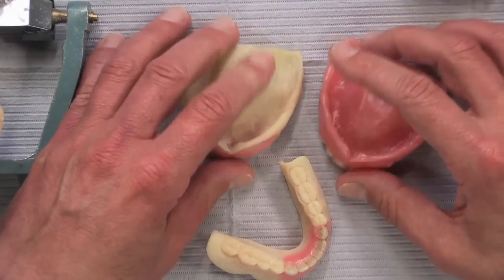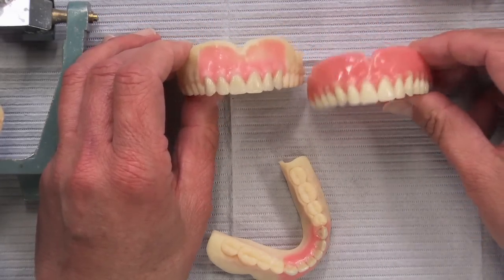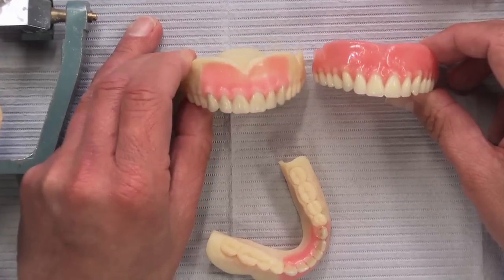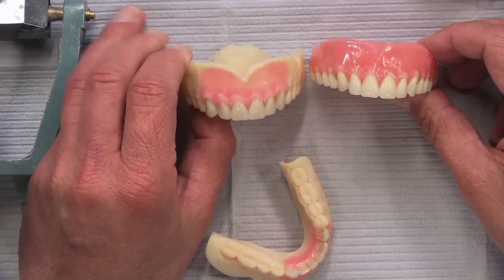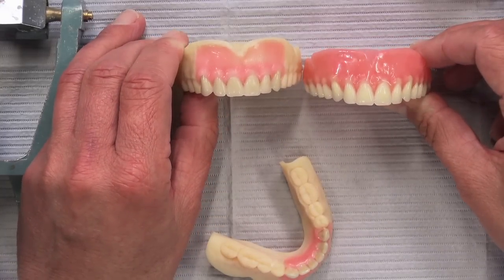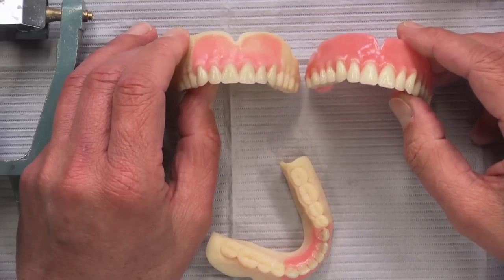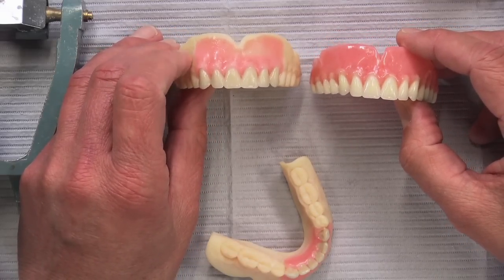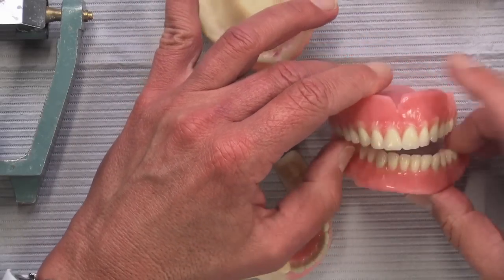The finish is smoother on the final acrylic than on the resin, which was not made to be worn intraorally for long periods. At the next appointment, you already know how that denture is going to fit because you had the try-in just a week or so ago. There should not be any surprises when you deliver the denture — that was definitely one of the things before where you had to cross your fingers a little bit.